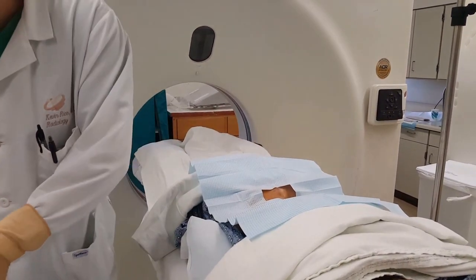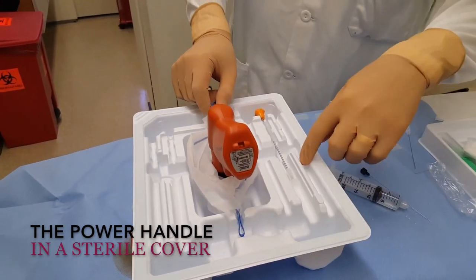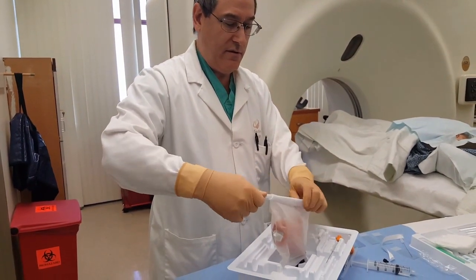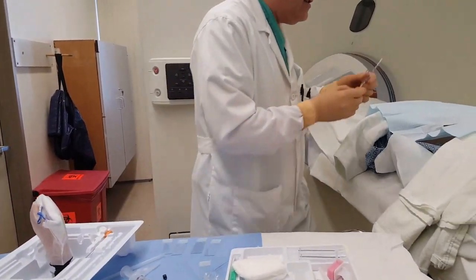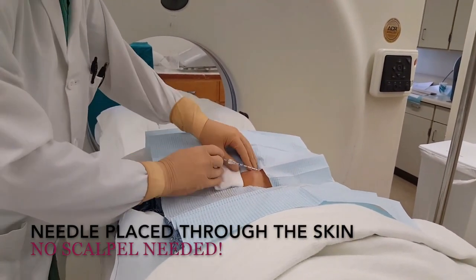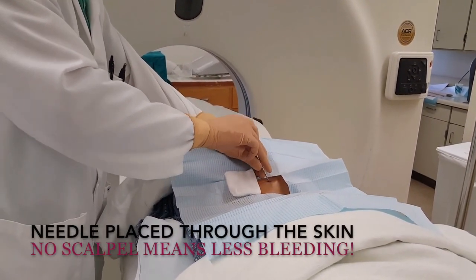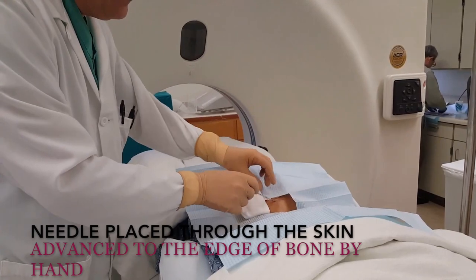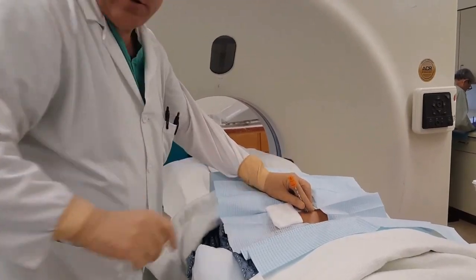Back here, this is the power handle. My tech David has already put it in the sterile bag — it was just dropped in. The handle is not sterile, so we put it in a sterile bag. I'm going to get this needle in place. You can make a nick in the skin — my tray comes with a scalpel — but it's fine if you just gently advance with a little twisting motion. You can get it through the skin nicely and then there's less bleeding afterwards.